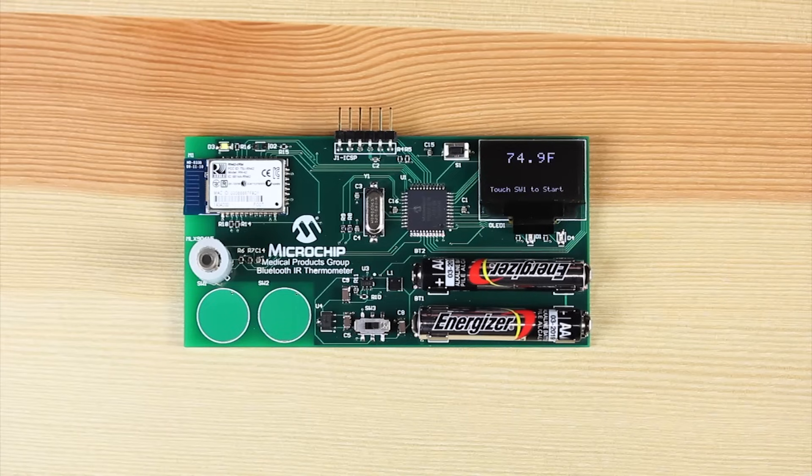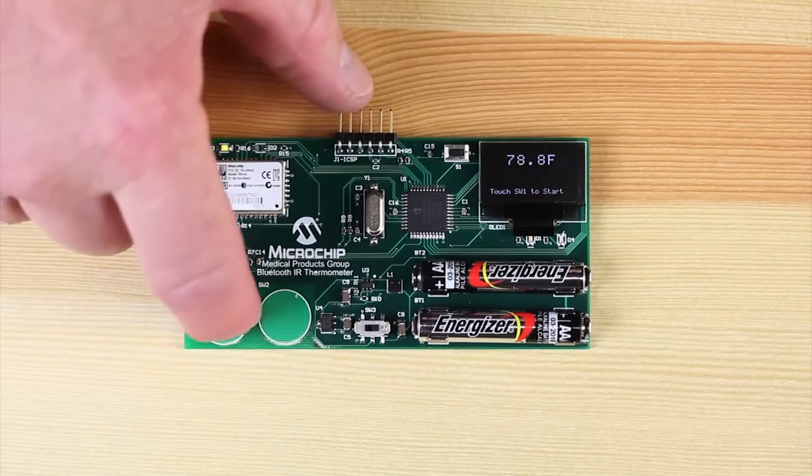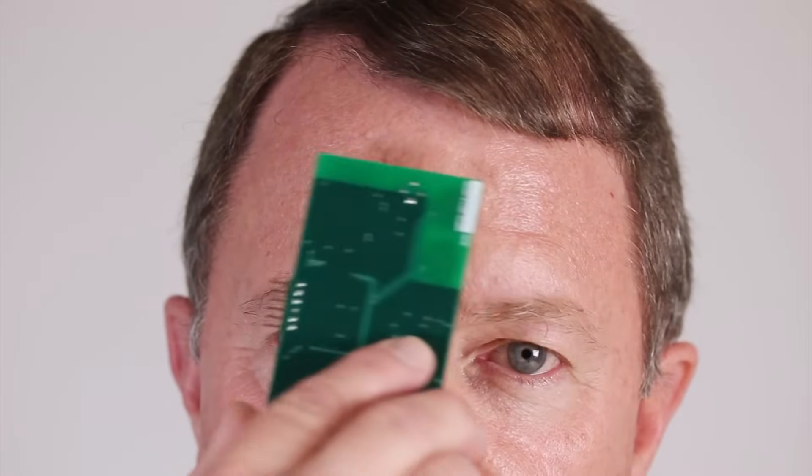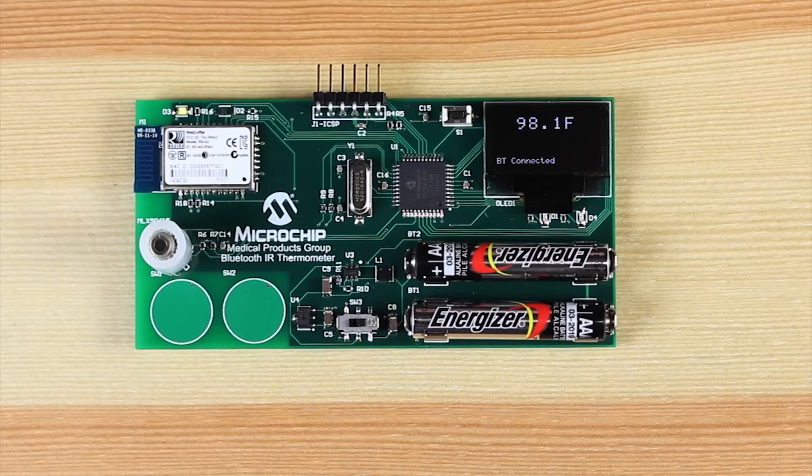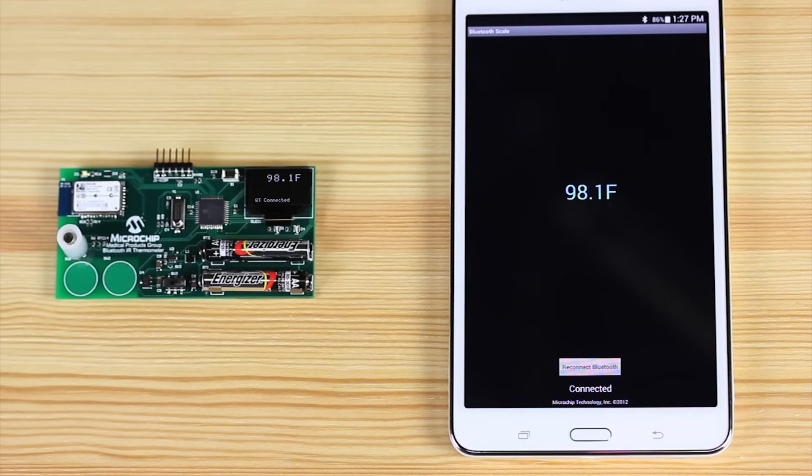The demo uses an IR temperature sensor. To get the temperature, I'll push one of the capacitive touch buttons and then run the thermometer across my forehead. As you can see, the temperature is displayed both on the OLED display as well as transmitted to the tablet via the RN42 Bluetooth module.